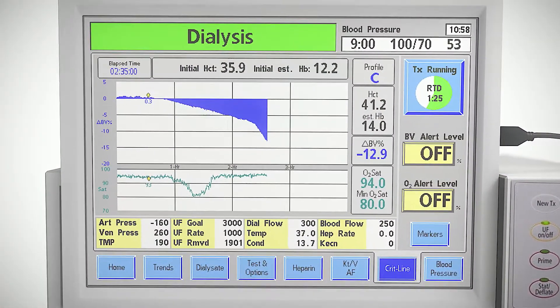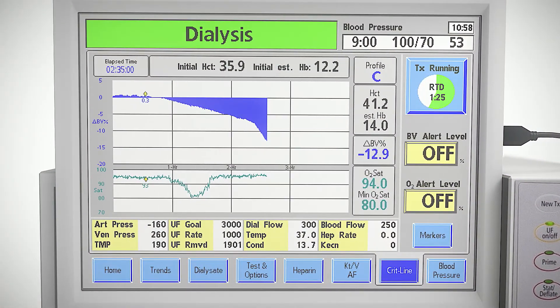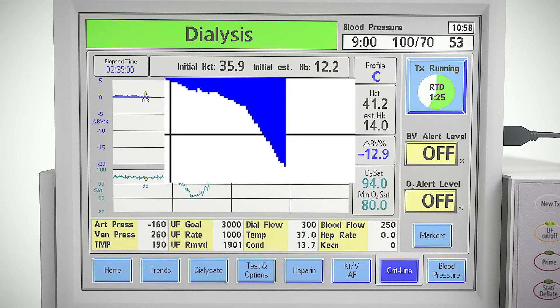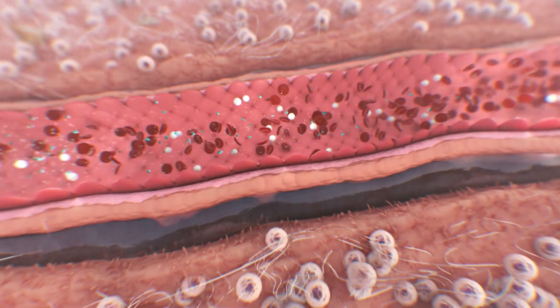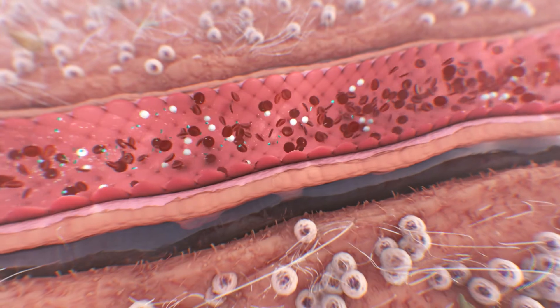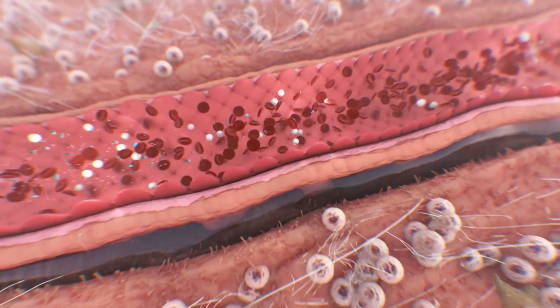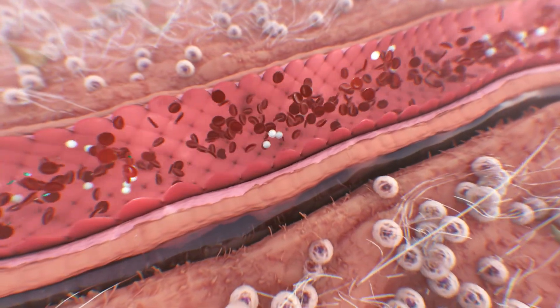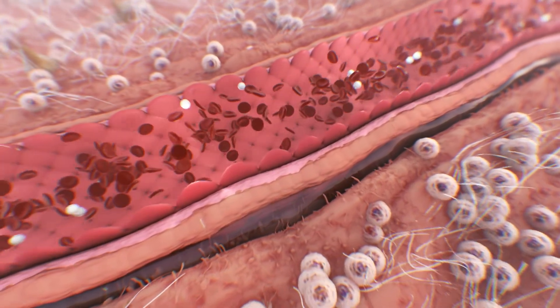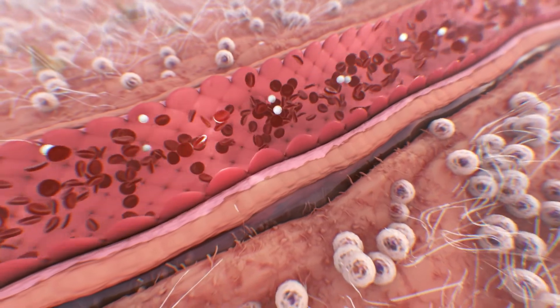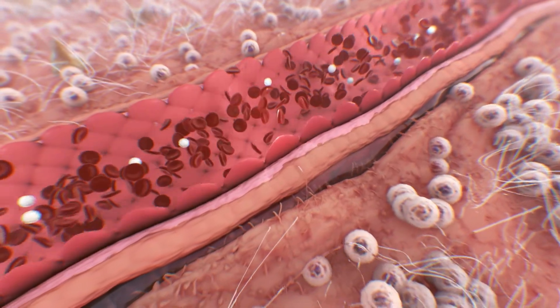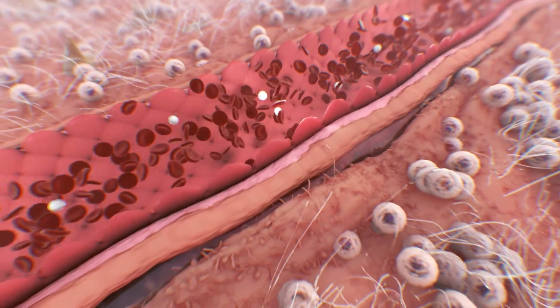Profile C is represented as a steep slope. This indicates a rapid decrease in blood volume and significantly higher hemoconcentration of red blood cells due to a high rate of ultrafiltration, bearing a higher risk of intradialytic symptoms which include cramping, dizziness, and vomiting.